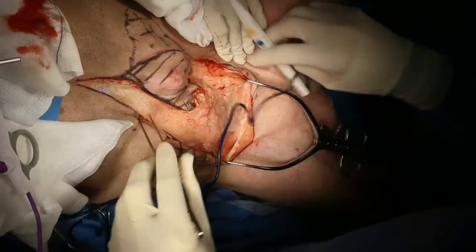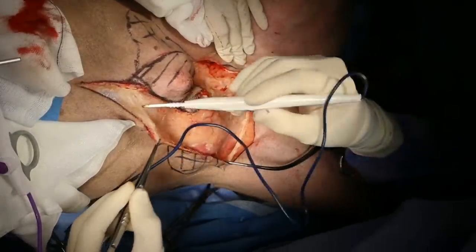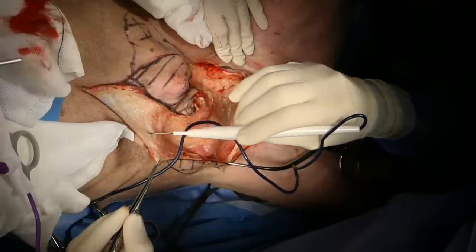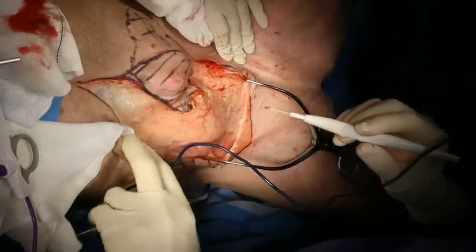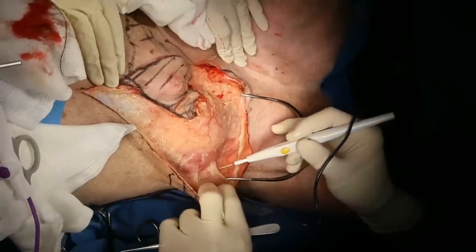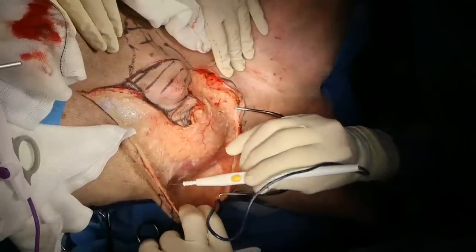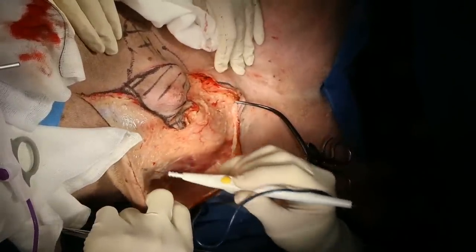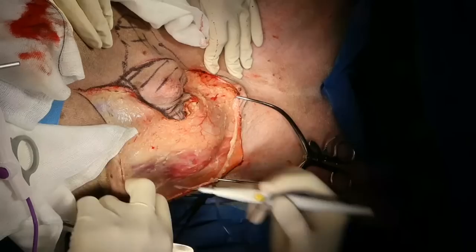Going back and palpating mass here. Can I get some Senn retractors, please? A couple of pairs. So I can palpate mass all the way out to there, all the way out to here. Let's see, external abdominal oblique muscle there. Or is that rectus muscle? Rectus muscle.